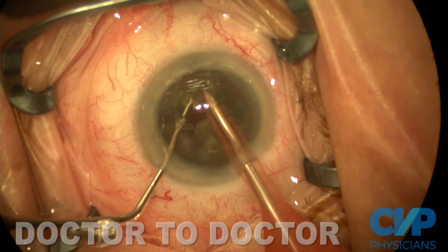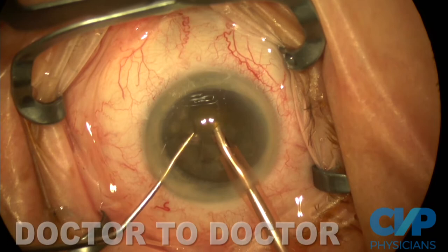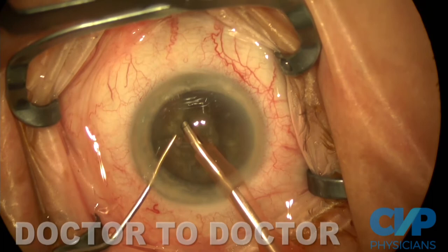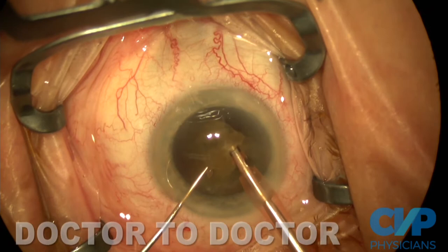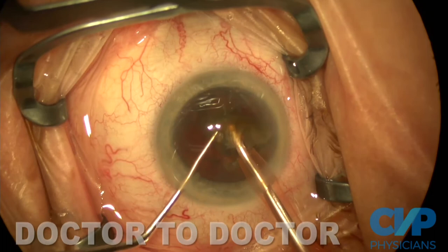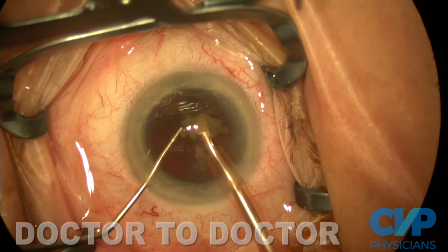My goal when removing segments is to rotate — I grab the anterior portion of the fragment and rotate it so that the smooth posterior surface of that fragment is now horizontal to the iris plane. Then I just let it rotate on the tip of my phaco handpiece. That way you don't have pieces chattering in all sorts of directions, and you don't have sharp jagged nuclear edges up against the corneal endothelium. Through all of this time, we haven't had to put any additional lubrication on the ocular surface — this Viscoat will last for the entire case without any additional intervention.